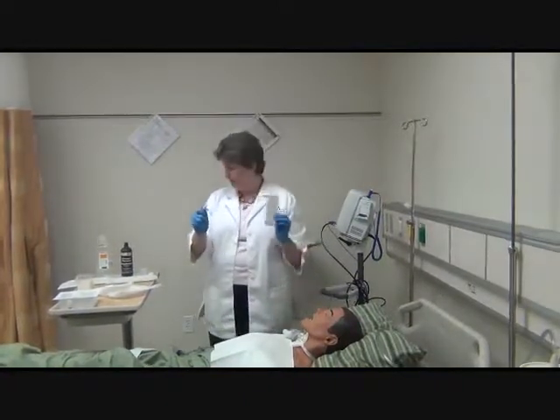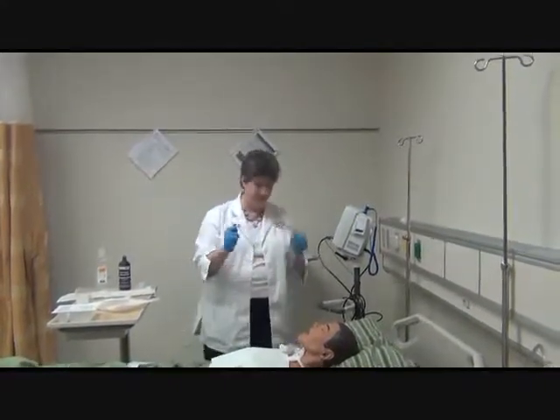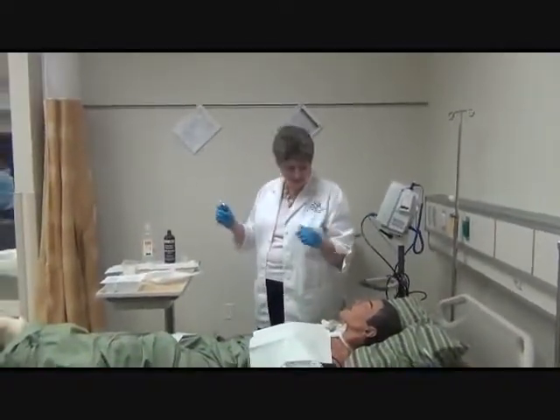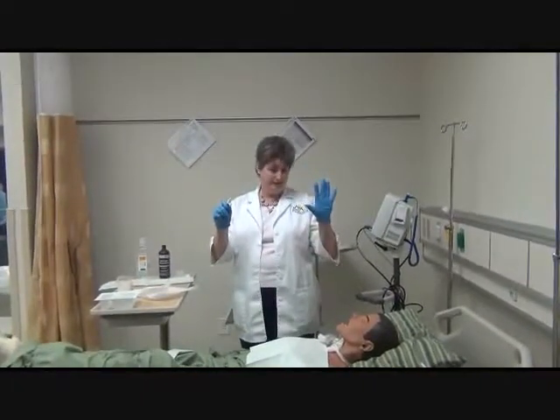I'm now going to throw this away because, again, it's trash and I don't need that. Put it in my trash can, and I shouldn't have gone below my waist, but we put it in the trash can. At this point, this is my sterile hand, this is my non-sterile hand.